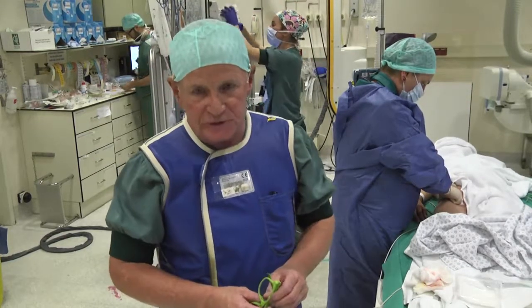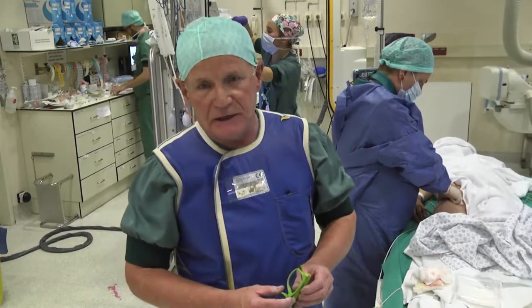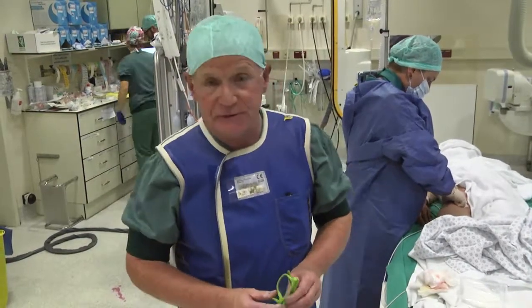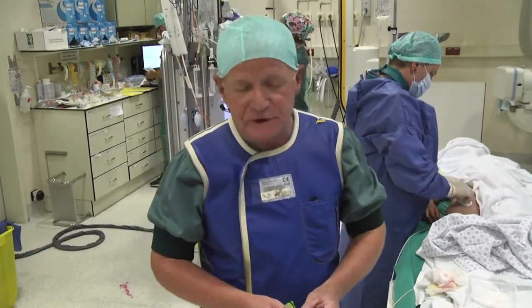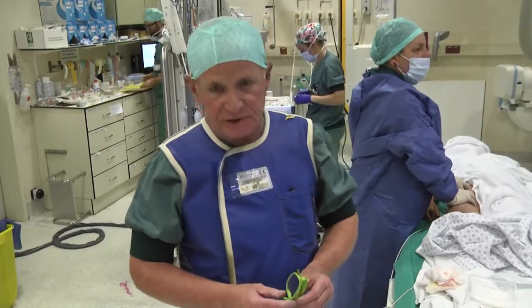Now with the new Ensemble system, it is an extra safety you can add, and although I must admit this is melody number 220, something like that, I have never ever had the stent move distally during deployment. I've never seen it. But an extra safety will not hurt.